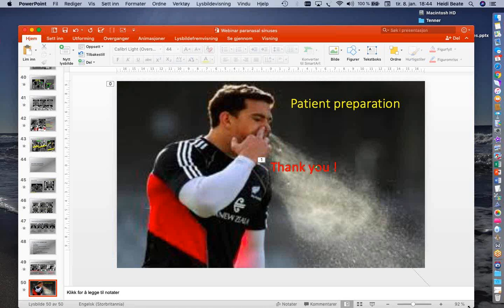Laura Neemane. What do you think of using CBCT for sinus imaging? That's a good question. It's very nice for the bone algorithm, but what you cannot do with cone beam CT is reconstruct with the soft tissue algorithm. So I think you lose a lot with the cone beam when it comes to the paranasal sinuses. And if you see an opacification at cone beam in the paranasal sinuses, you always have to do an MRI. And in Norway, we do not have capacity to do so much MRI. So I think it's better not to use cone beam CT for the paranasal sinuses.